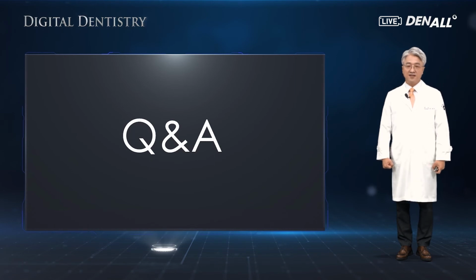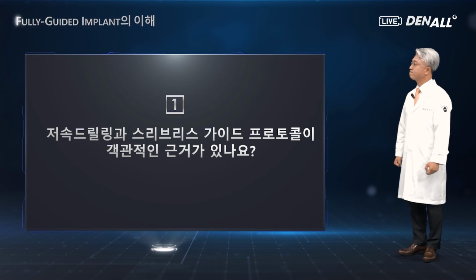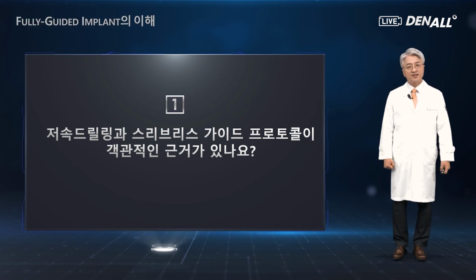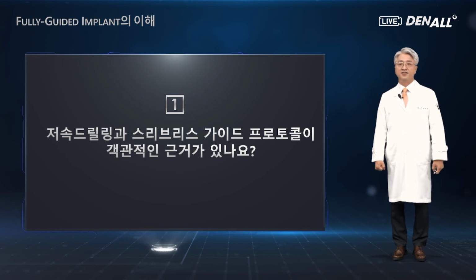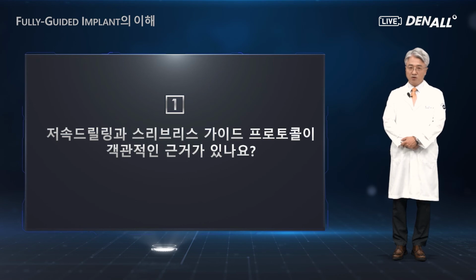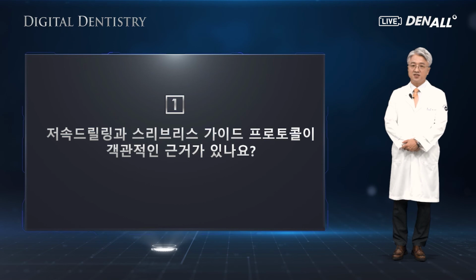Q&A. So let's look at some questions. Low-speed drilling and sleeveless guide protocol. Is there any objective evidence for that? The protocol actually doesn't have objective evidence.